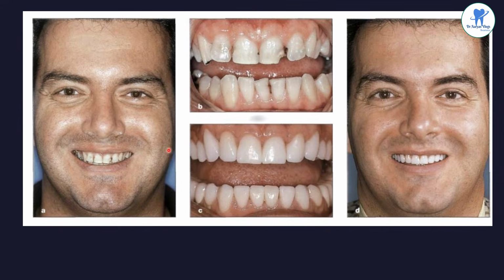Here, the advances in dental technology now allow the clinician to improve the patient's appearance with minimally invasive techniques. Here, the upper and lower dentitions have been treated with porcelain laminate veneers. Even severely decayed teeth can be restored successfully with porcelain laminate veneers, improving health, function and aesthetics.